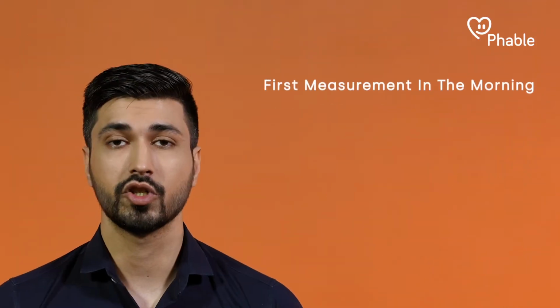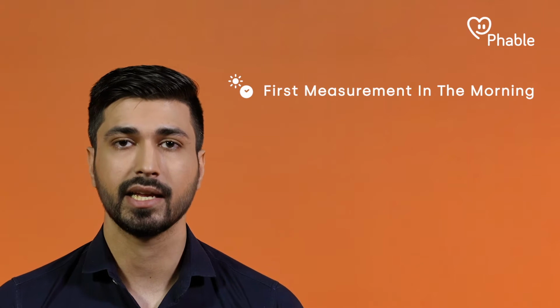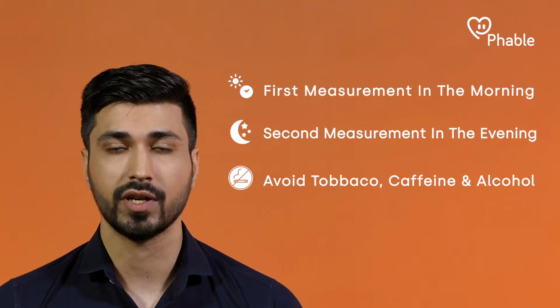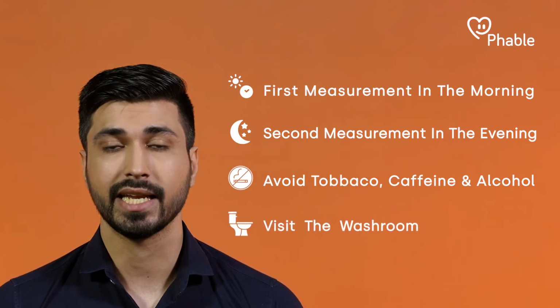The first measurement should be taken in the morning, before eating, bathing, exercising, or any medications, and the second in the evening. You should avoid tobacco, caffeine, and alcohol for at least 30 minutes before taking your measurement. You can visit the washroom before your reading, as a full bladder can increase your BP slightly.